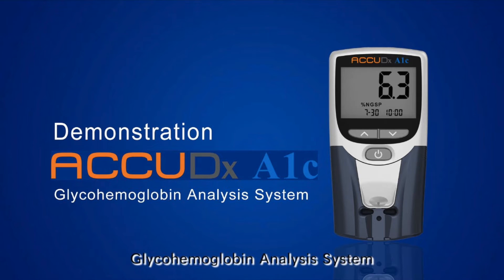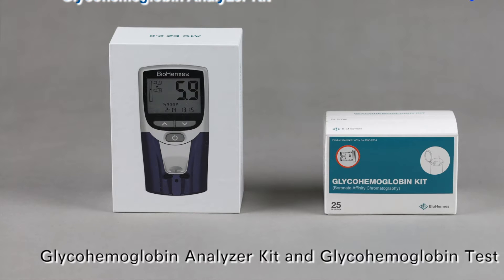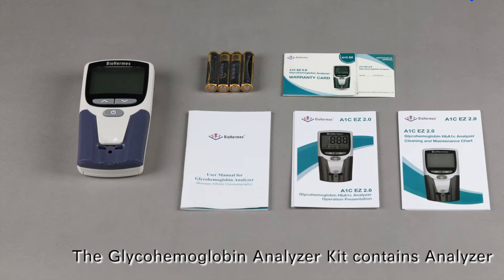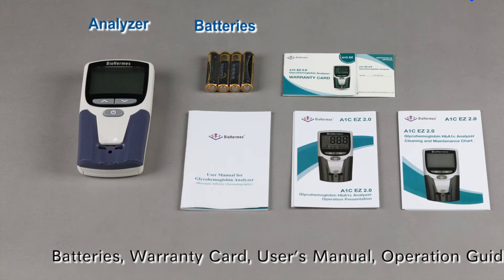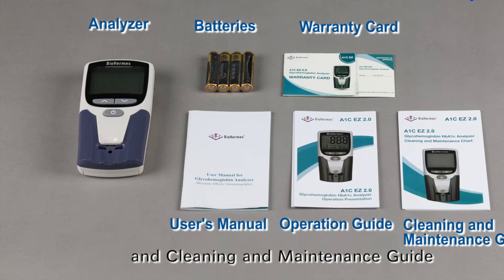GlycoHemoglobin Analysis System. The system can provide accurate HbA1c results. Part 1 consists of two parts. The GlycoHemoglobin Analyzer Kit contains an analyzer, batteries, warranty card, user's manual, operation guide, and cleaning and maintenance guide.